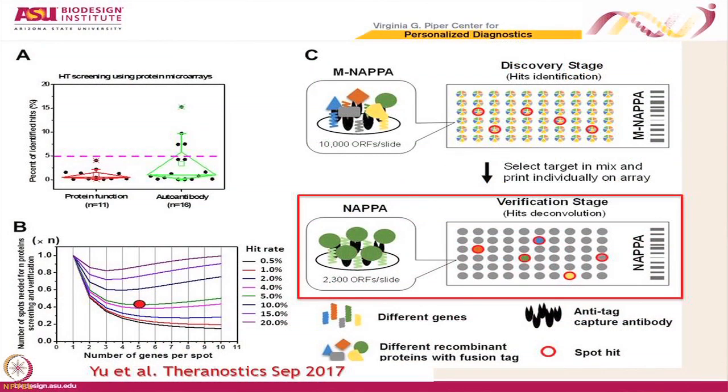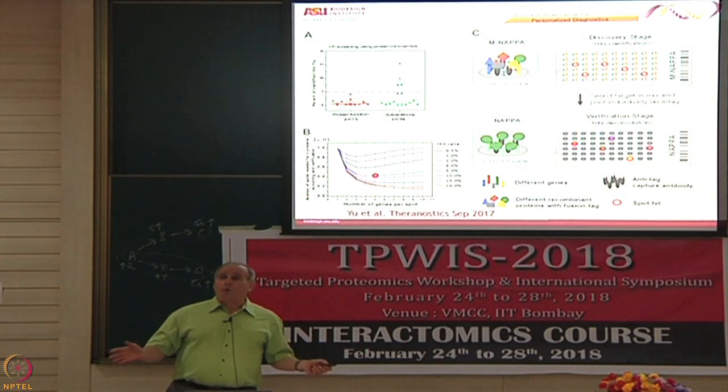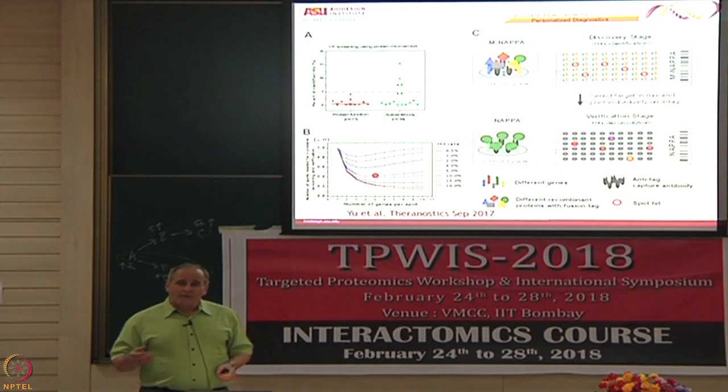And so that would be the strategy. Does that make sense? So we call that the deconvolution step. It's sort of verification stage and deconvolution stage. Okay, so does it work? So what would be an experiment to make sure that it's working?